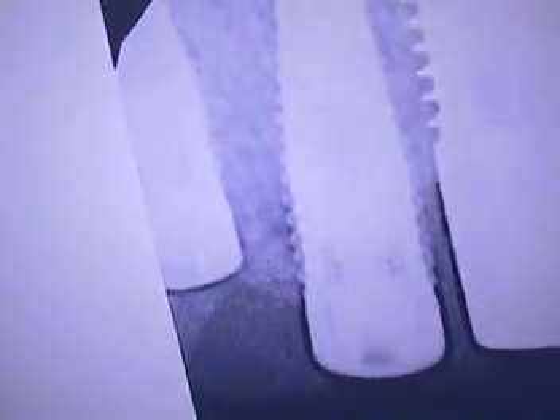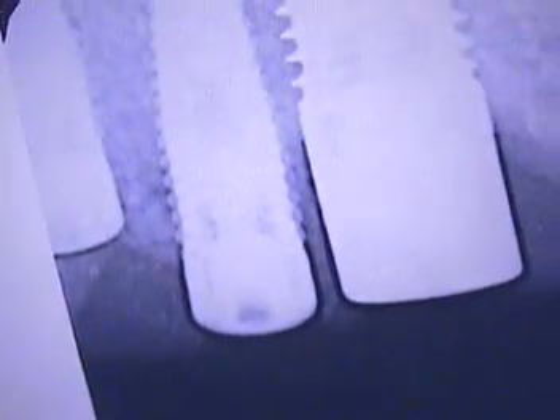Let me show you the x-rays. This is the upper right side. We have a very large implant on the cuspid side, and then we have the first bicuspid, second bicuspid, and the posterior. So I might have my hands full on this.